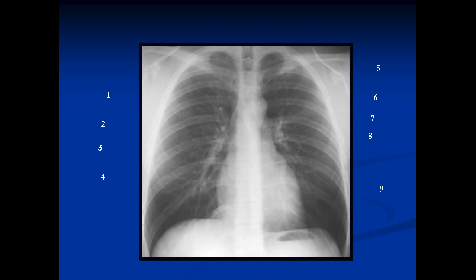We're going to start with the PA view of the chest, and the first structure we're going to talk about is the superior vena cava. Here we've got an arrow — there's an interface, a line you can see adjacent to the mediastinum. On one side of the line is white, on the other side is black. The reason we see this line is because it's an interface between air and soft tissue. If there's no air next to the mediastinum, we will not see the structure. This line comes all the way down from the neck right to the region of the right atrium, and that line is formed by the superior vena cava.